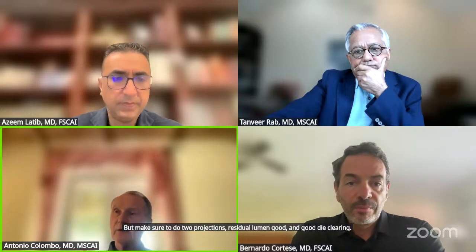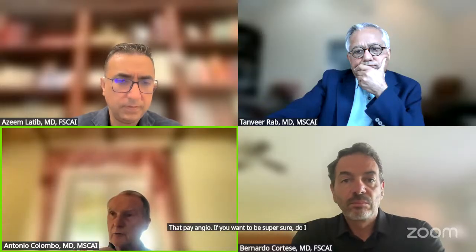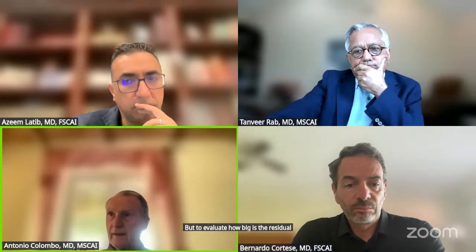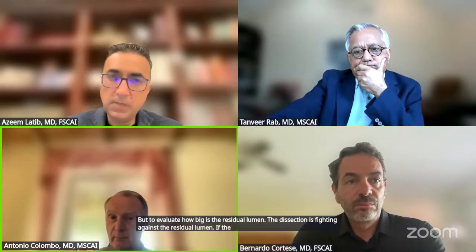That by angio. If you want to be super sure, do IVUS, not to see the dissection, but to evaluate how big is the residual lumen. The dissection is fighting against the residual lumen. If the residual lumen is big, the residual lumen will win over the dissection.